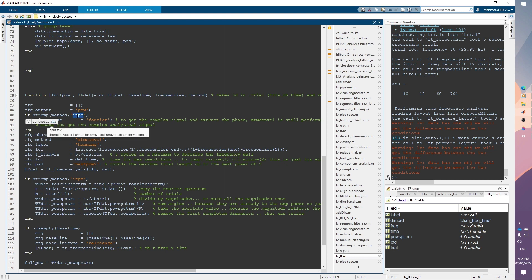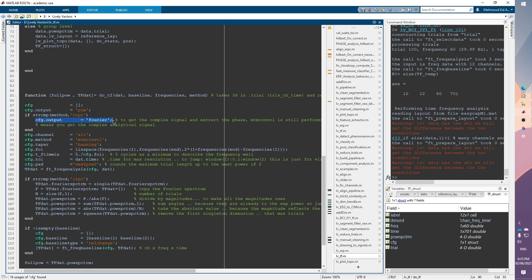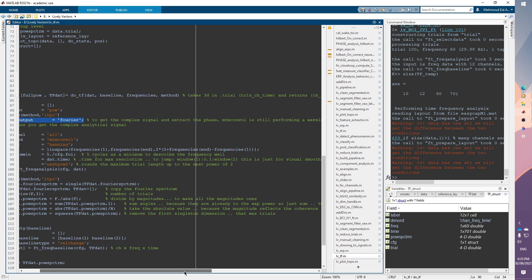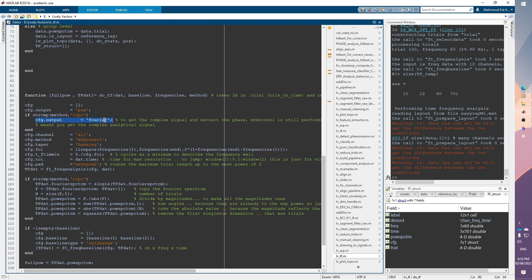Here we check that this is the method, and the output will be different. Instead of estimating power, we will be estimating the full Fourier spectrum — returning a complex value, the full Fourier coefficient — so we have the ability to extract both magnitude and phase information.